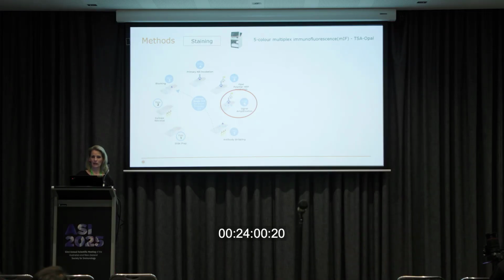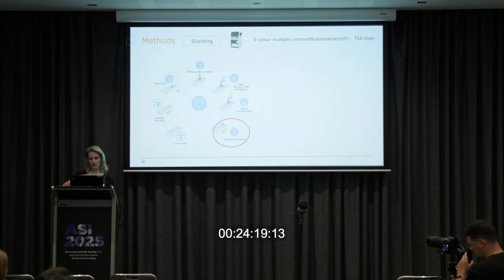That was the reason we initially started looking at TSA, so we could run 2 or 3 mouse antibodies, but we actually have quite a good added benefit of having that amplification. For our tissue, being colorectal and high in collagen, we have quite high autofluorescence in the background, and that TSA signal amplification helps.